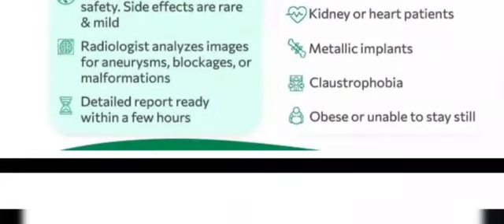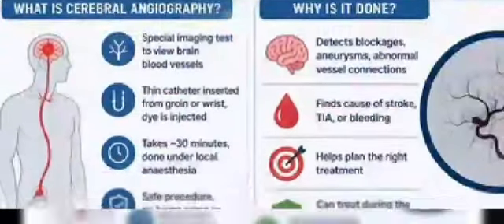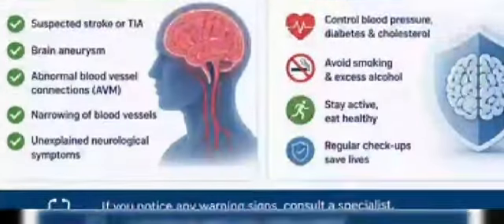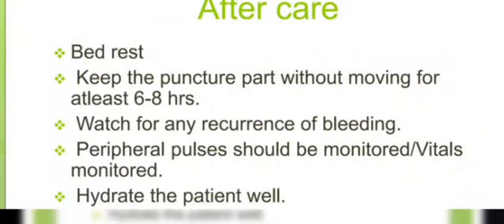So, next is about the complications and post-procedure care. What is the post-procedure care? The patient should be on bed rest, should not stand up.